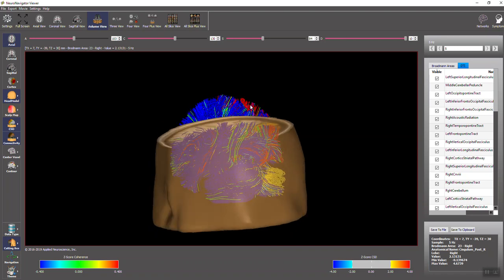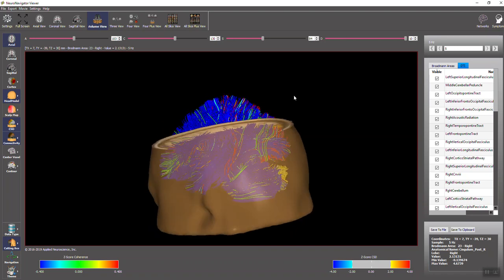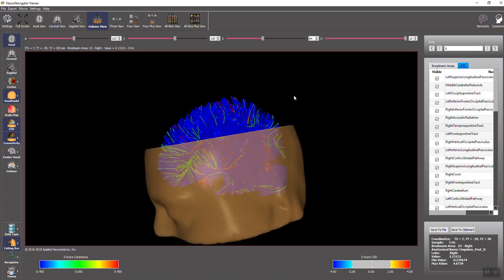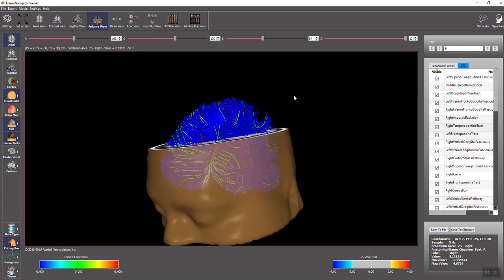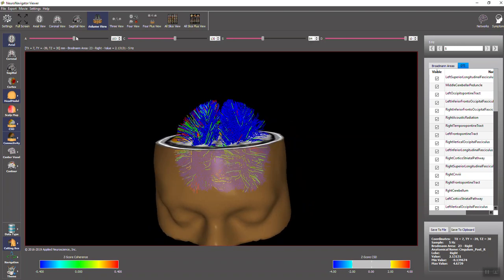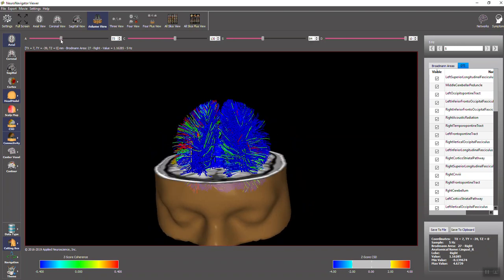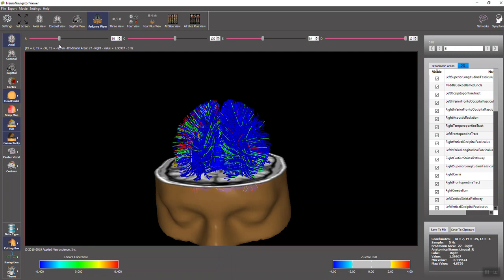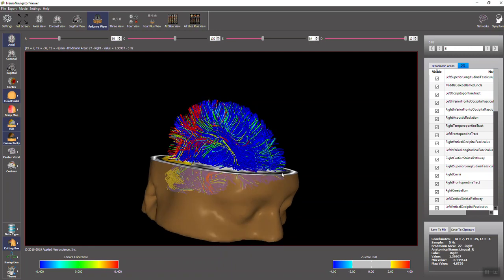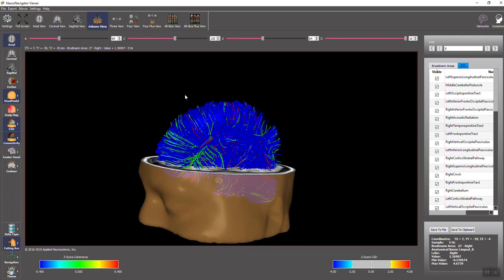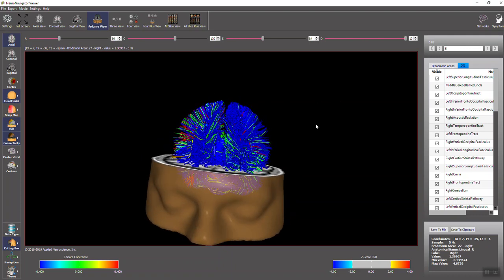We can move the scale down or the axial slice, so you can visualize the diffusion tensor imaging.